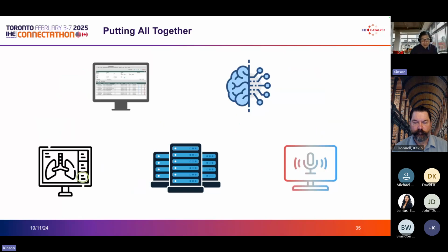Then the user looks at all the results that have been identified so far, picks one of the more important ones, and wants to incorporate that into the report. So the user selects one of the findings, and with that action, selecting the finding, the PACS can send a select event to the hub, and that select event references that specific finding or observation.